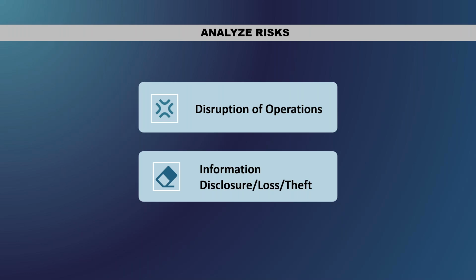You have your disruption of operations, which is the loss of availability, quality, and continuity of healthcare services, which is a primary concern with any physical sabotage, natural disasters, or any malware that affects the network. Additionally, you also have DoS or DDoS or ransomware attacks that can be executed and overwhelm system resources and network connected devices, impacting operations.